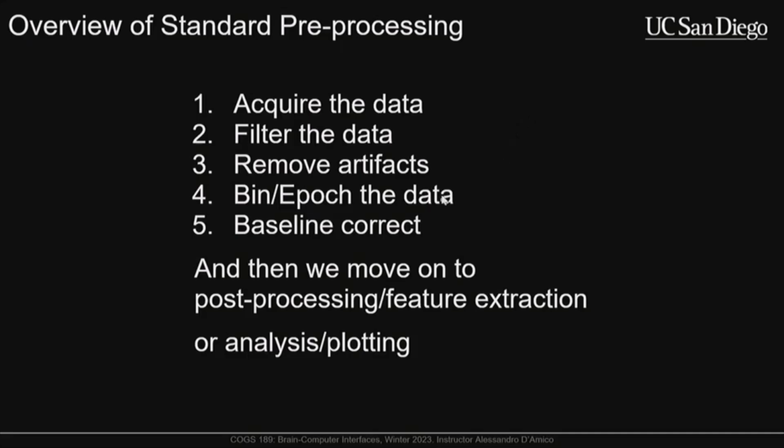We remove artifacts. Common artifacts include the electrodes moving around from people walking around, or even from talking or clenching their jaws. Eye blinks are a huge artifact. Sometimes they're a signal.